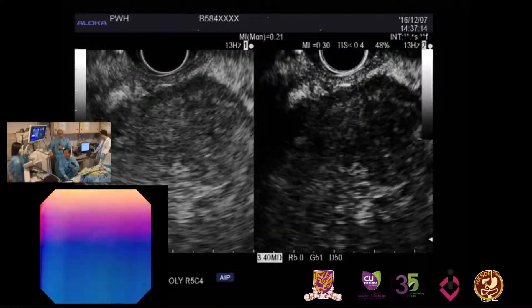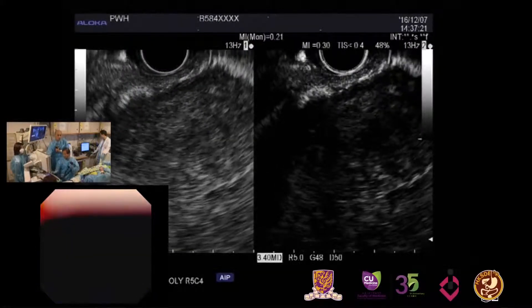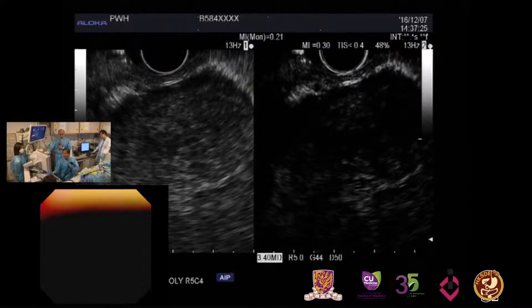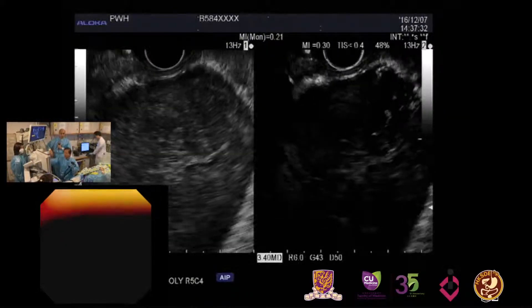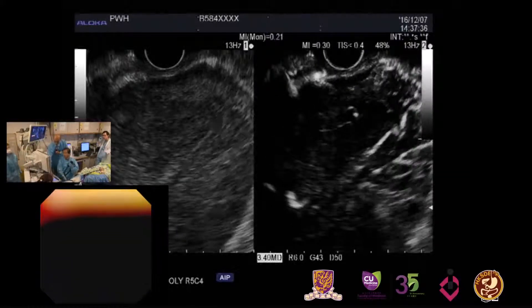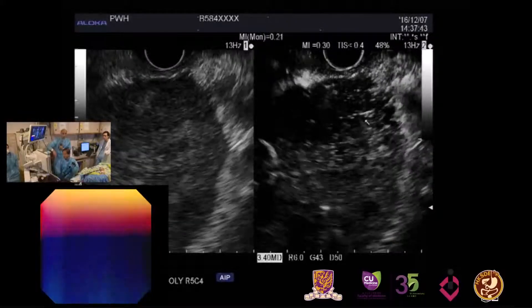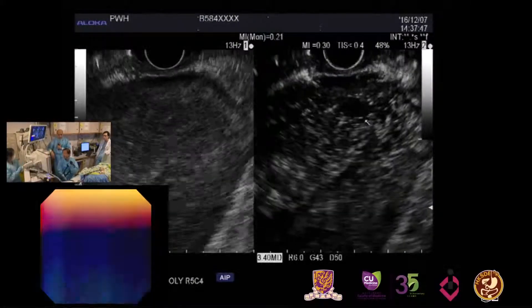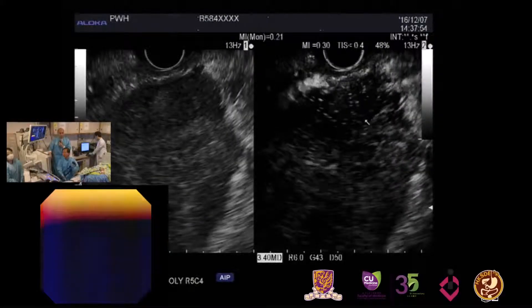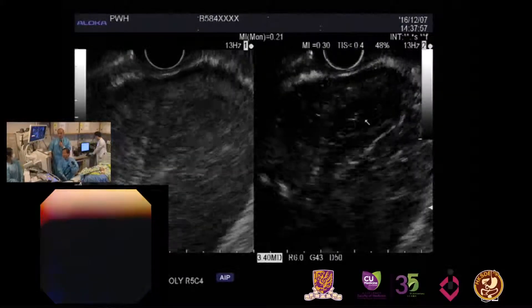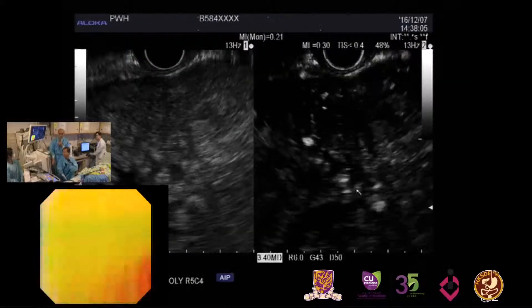Now contrast is ready. We are going to use second generation SonoVue here. Inject. If you want to see just the enhancing pattern, we need to gain a little bit down. Enhancement generally starts from 20 seconds. You can see the contrast is going inside here — there are tumor vessels traversing. Some area shows well enhancement, homogeneous, but this area does not show good enhancement. As I mentioned earlier, there is a mix of homogeneously enhanced areas and non-enhancing areas. This feature also suggests this lesion is probably malignant.